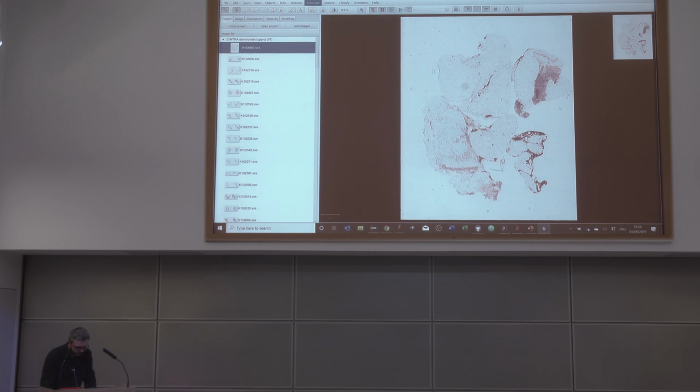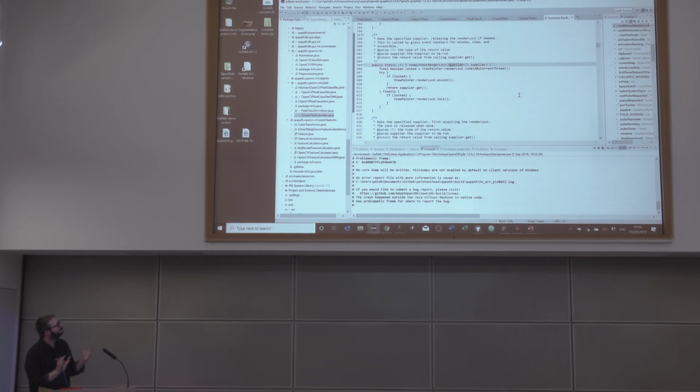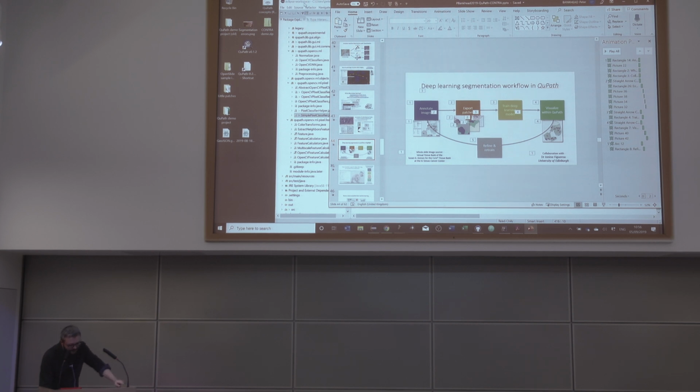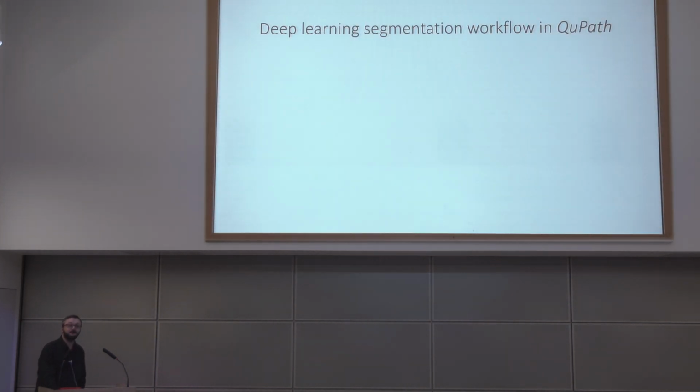So here, if I open up this script, it's still a prototyping proof of concept stage, but I hope, yeah, it's going to end up crashing. For the first time, I tried that today. But yes, you might have got a glimpse there whenever it opened up, where it was able to show the beginning of the deep learning classification through the pixel classification framework. I think I know what I broke there, but that's going to be a task for another day.